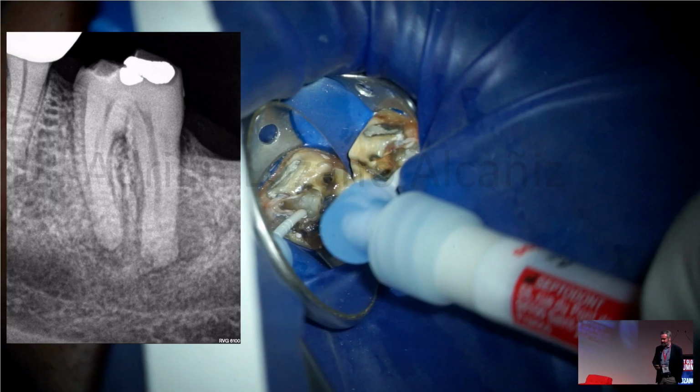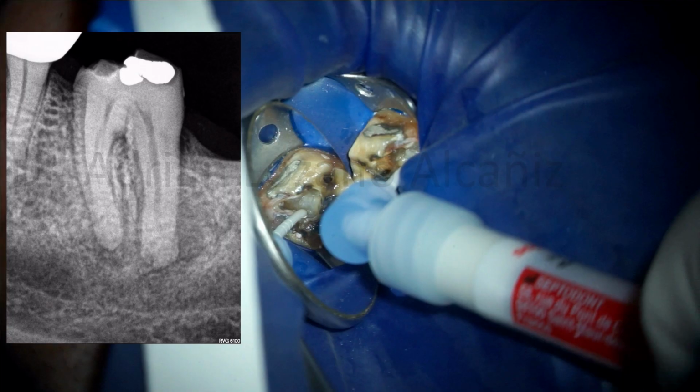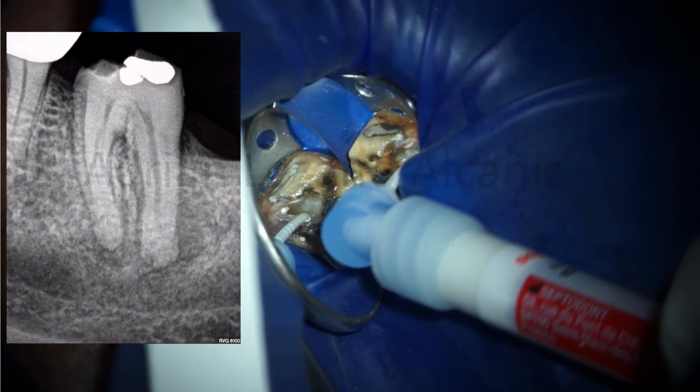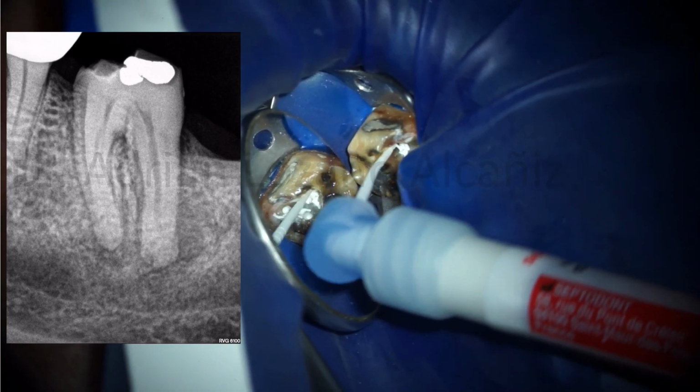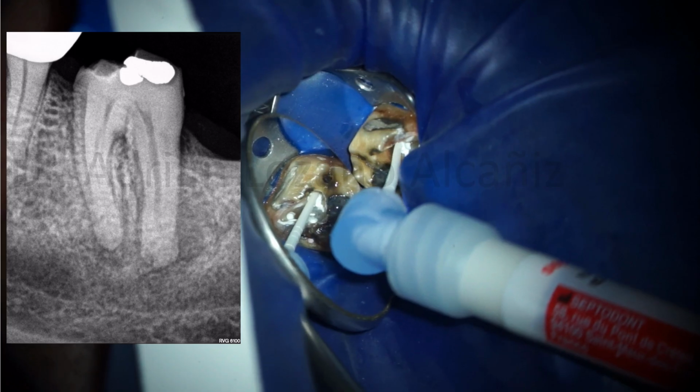And the second case is this 36, a necrotic 36. We have 2 lesions, in the mesial root and in the distal root. The lesion of the distal root is lateral, so we clean and shape. It's very difficult to clean and shape the distal root. Then we put the sealer with the syringe. This is the mesial and the distal one.